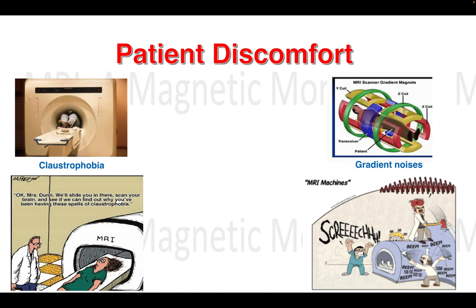Due to Lorentz forces of gradient coils, MR imaging is loud and can be very uncomfortable for the patient. So MRI technologists are to give earplugs and provide headphones for music to eliminate some of the noise during the MRI exams. The Lorentz force is also known as the electromagnetic force. It's a combination of electric and magnetic force on a point charge due to electromagnetic fields. We'll cover Lorentz force in the safety module as well.